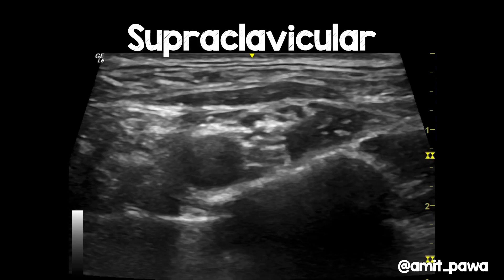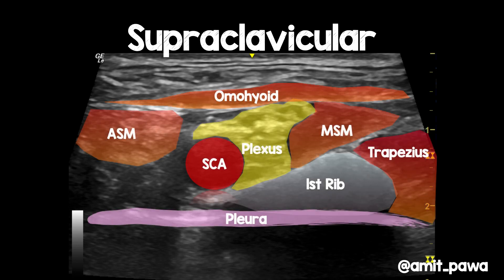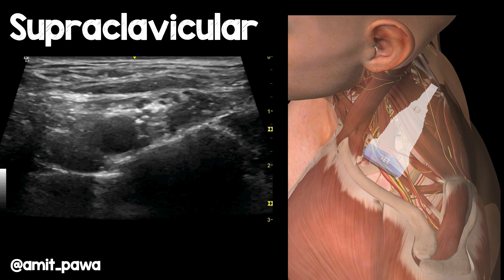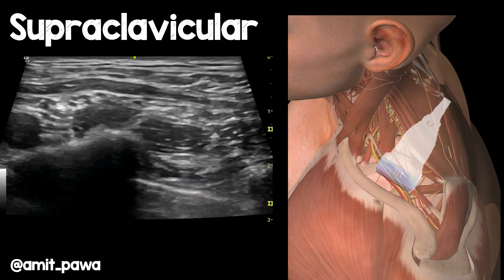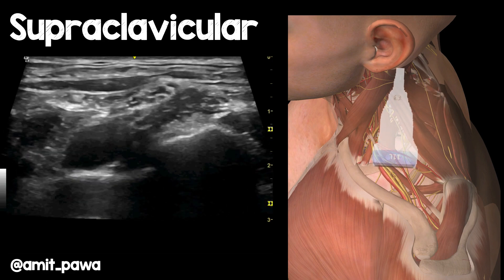This is the type of image one might generate when performing a supraclavicular block. The bright white line you're looking at is the first rib — not the clavicle — because you're scanning posterior to the clavicle. Adding some colour overlay, you can see the pleura lying beneath the first rib, the omohyoid muscle, the subclavian artery, and the plexus lying posterior to it. You'll often see the middle scalene muscle inserting onto the first rib. Now let's see what this looks like if you scan it in real time. The probe is positioned on the first rib, and you can see that classical appearance of the slightly higher elevation of the posterior aspect of the first rib.